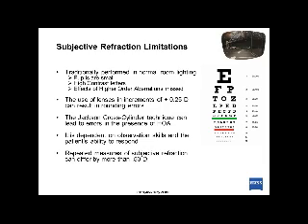Higher order aberrations are when the eyeball is shaped differently than a sphere. We're not talking cylinder. Sphere and cylinder are what are called lower order aberrations. Higher order is like the lens is not shaped perfectly spherical or aspheric. It's actually more like a potato, which is what most eyes are like because they are a living human being and part. So what we want to deal with is the shape of the eye, and with the iProfiler we're able to actually measure that.